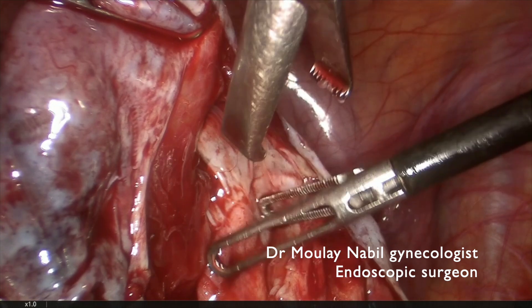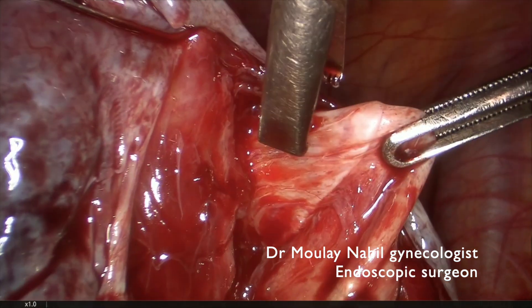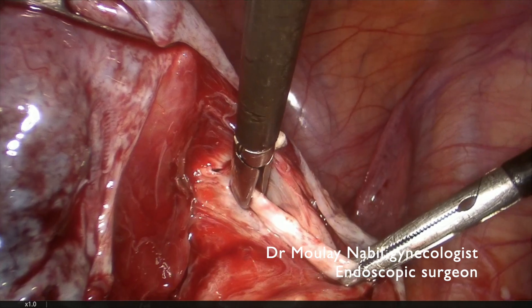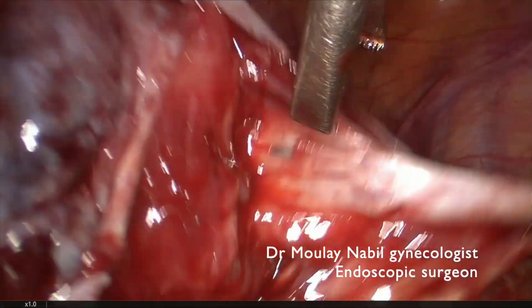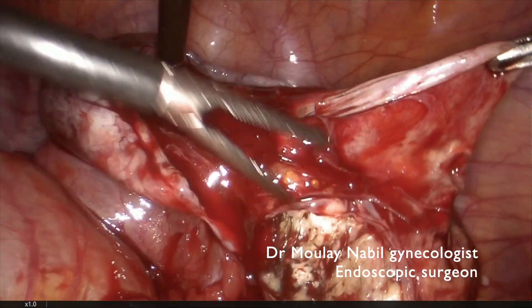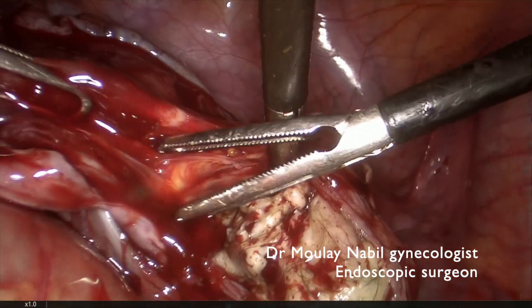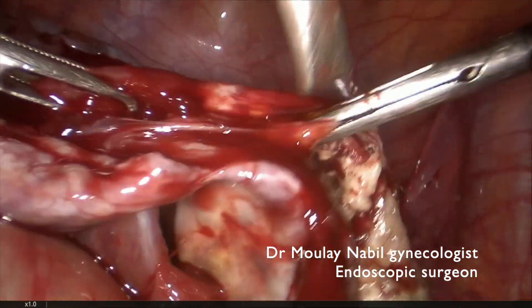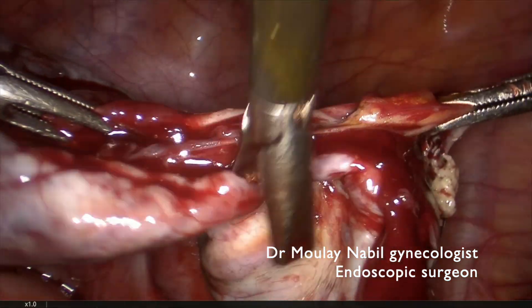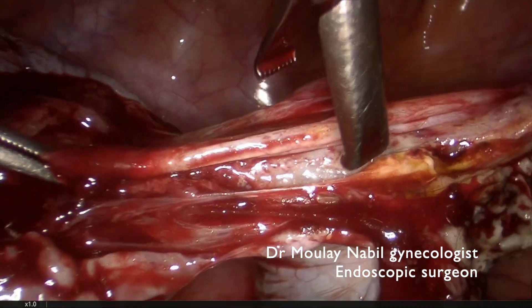For example, we can remove along the dissecting plane with counter-traction, and as you can see, we can remove this cyst quickly and safely.